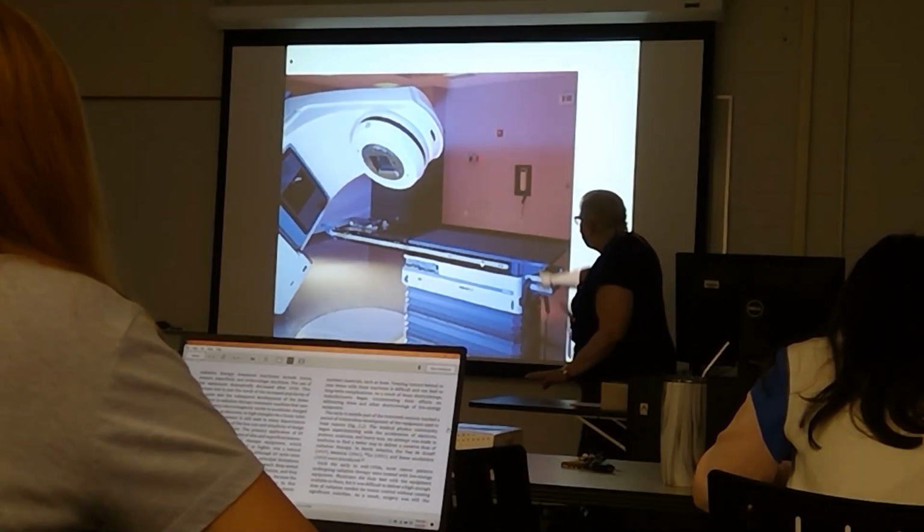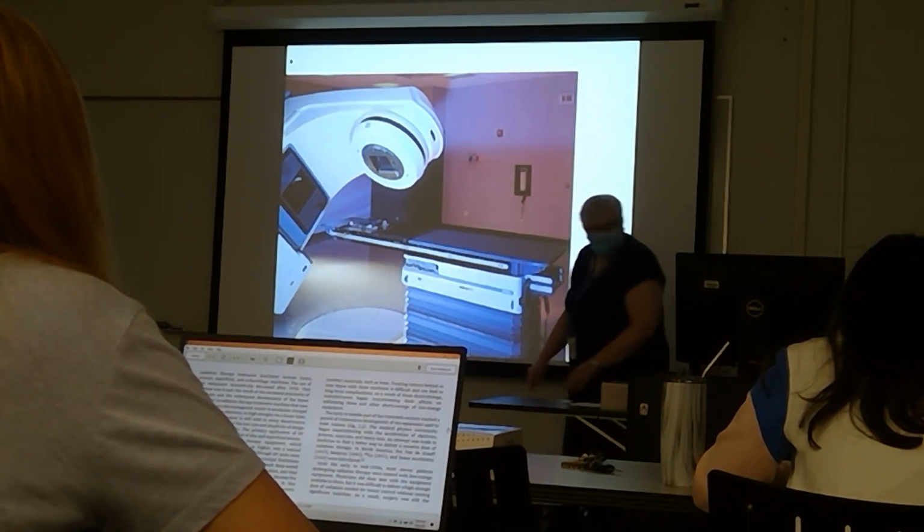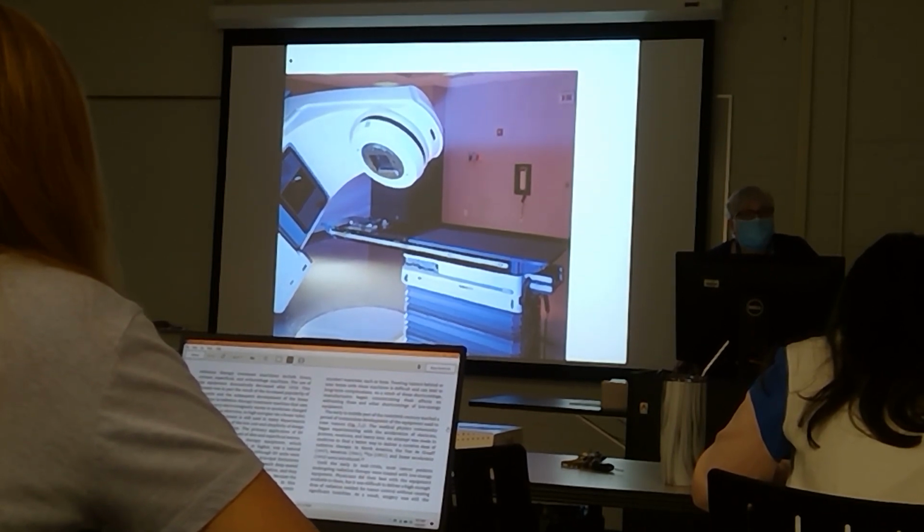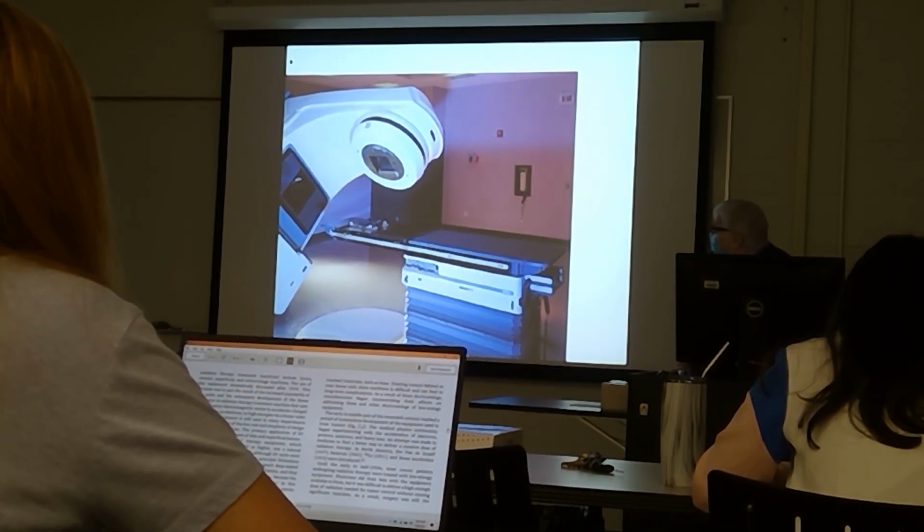Something different about the bed. It looks like it separates or something. Does it separate? Yeah, it looks like the top part moves away. Are there accessories attached to the bed, or is that the whole bed? That's the whole bed.